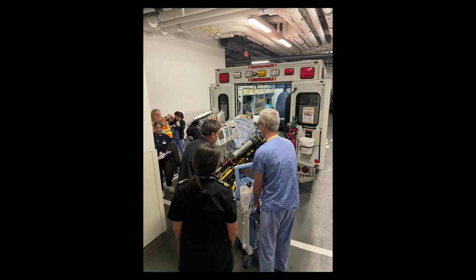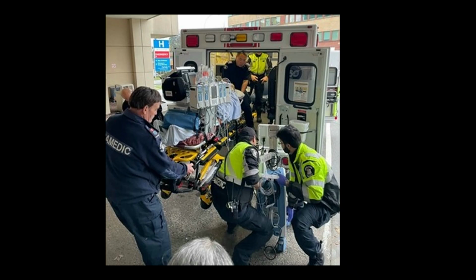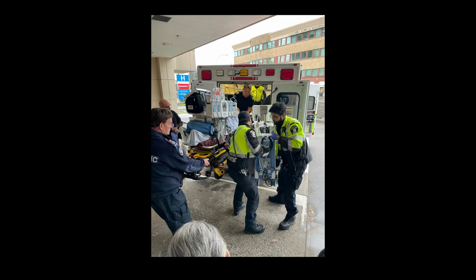The EHS crew will prepare the stretcher for loading. This is a critical point to verify that all lines are being monitored. EHS will load the patient into the ambulance in unison with the intra-aortic balloon pump. They will manually lift the balloon pump. It is very heavy. This is another view of the EHS crew members lifting the intra-aortic balloon pump in unison with the stretcher.